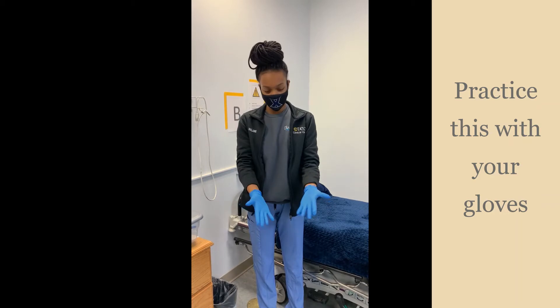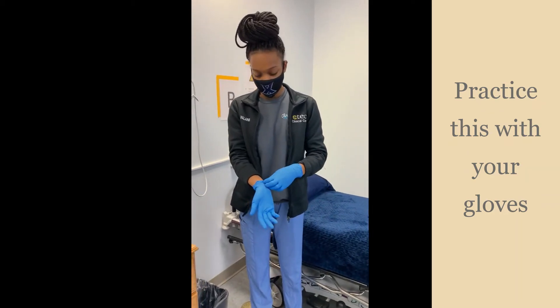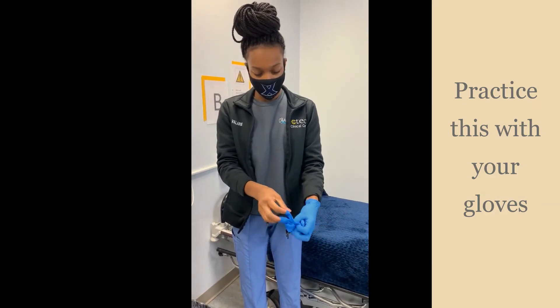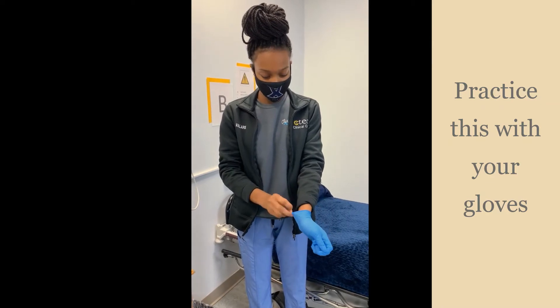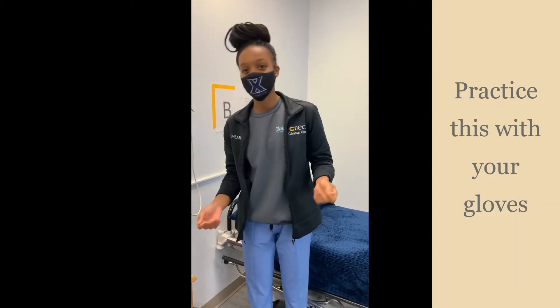Like that — cover your wrist. And then when you're pulling the gloves off, you want to make sure that you're pulling from the inside out. Tip that into this hand, making sure not to touch it, then throw that away. It's always best to wash your hands after you've taken them off.